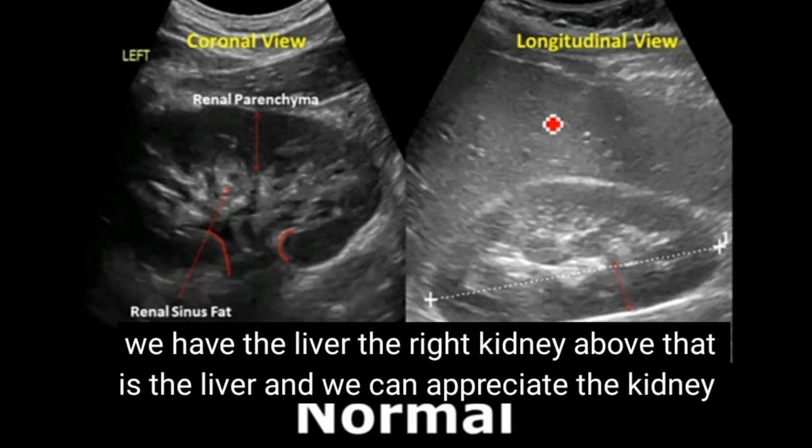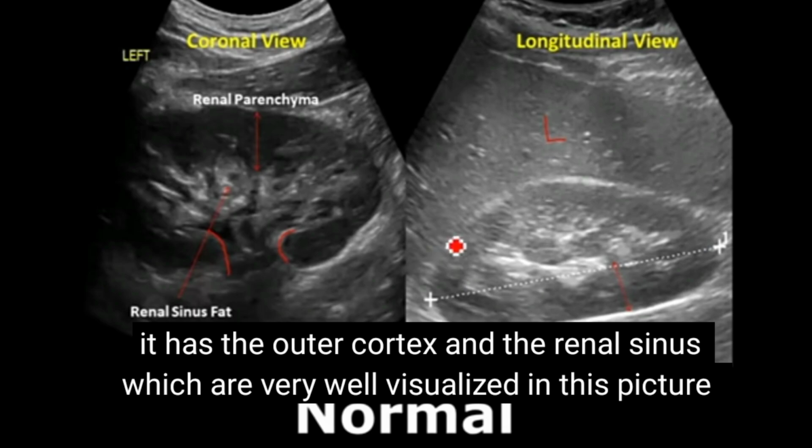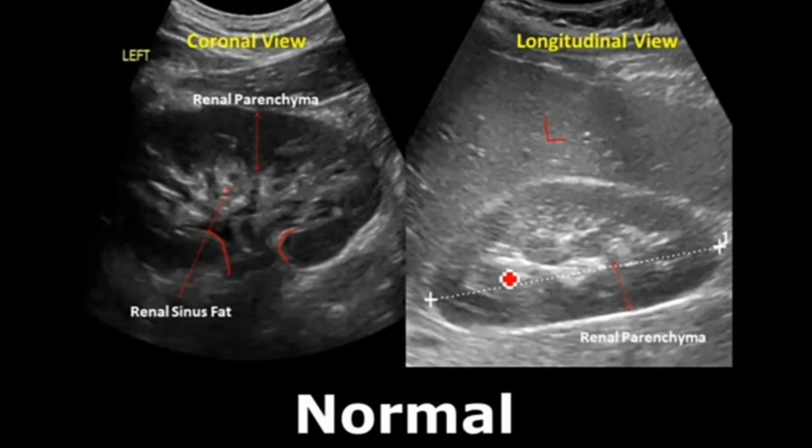And in the longitudinal view we have the liver and the right kidney. Above that is the liver and we can appreciate the kidney. It has the outer cortex and the renal sinus, which are very well visualized in this picture.